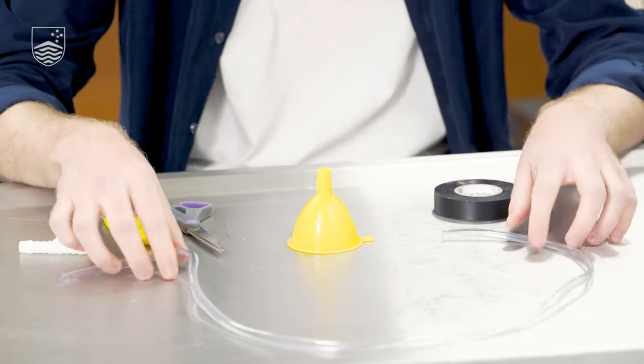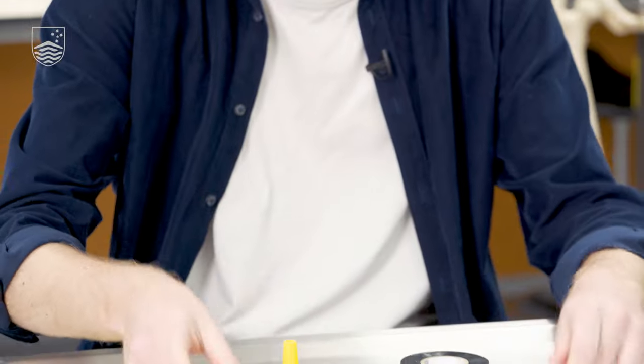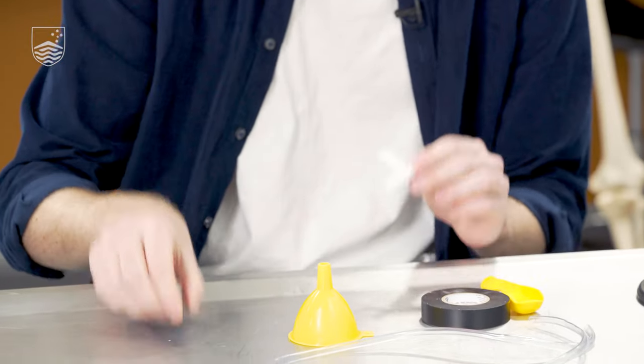So to make your stethoscope, you're going to need some equipment. We've got this long piece of clear vinyl tubing, a funnel, some tape, a balloon, this Y-connector, and you'll also need some scissors.